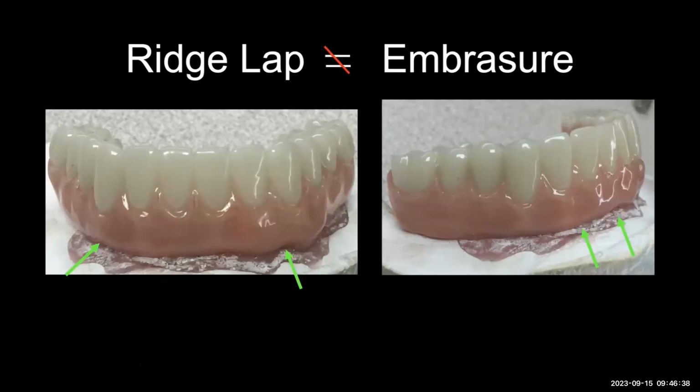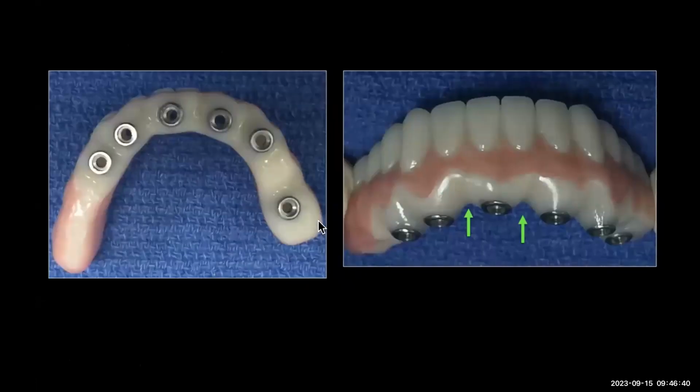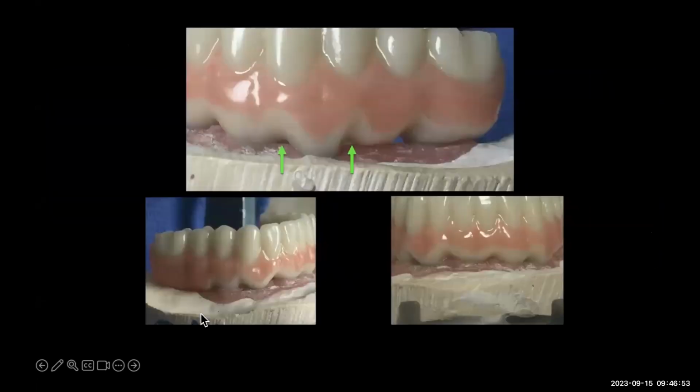So because of the ridge lap, there is no embrasure. So this is after it's modified. A sluiceway is put in between the implants. It's still kept basically convex, but the embrasures are put in. So when you go ahead and put this in the patient's mouth, now the patient knows where they have to get in to access between those implants.